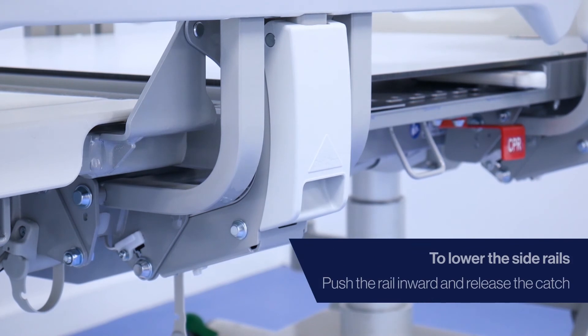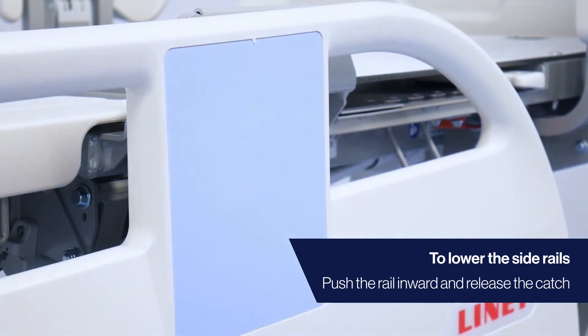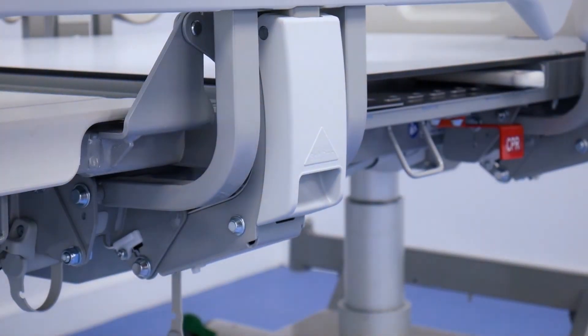To lower the side rail, push it towards the middle of the bed and pull the handle towards you. To raise the side rail, lift and lock into place.